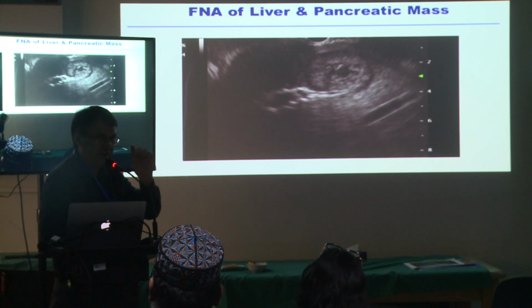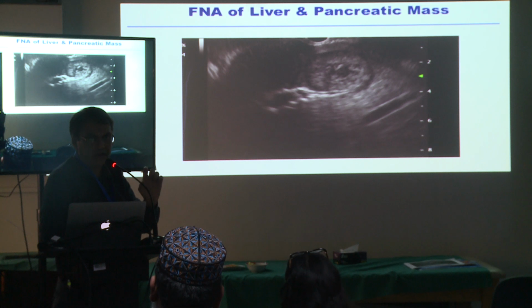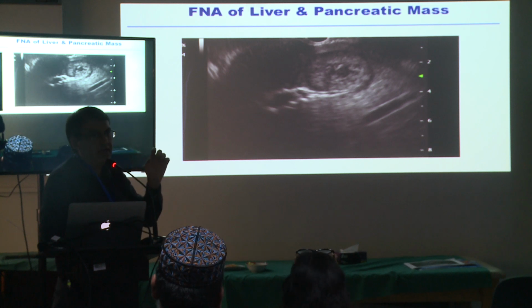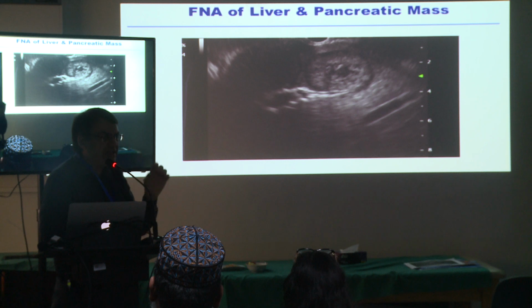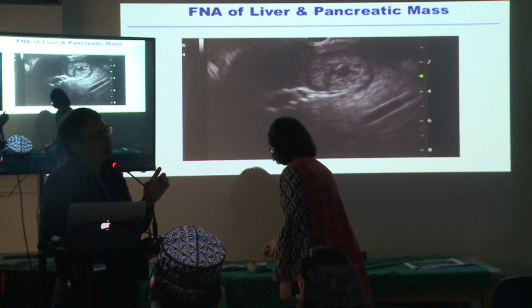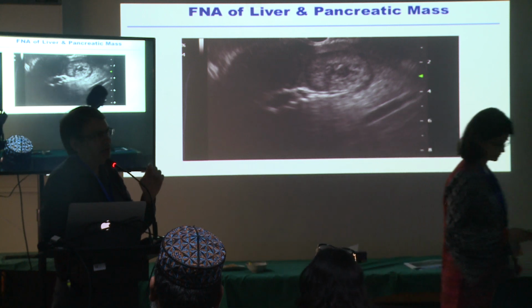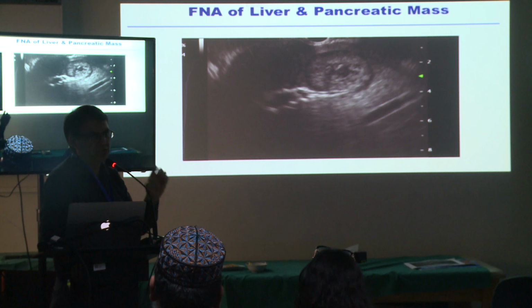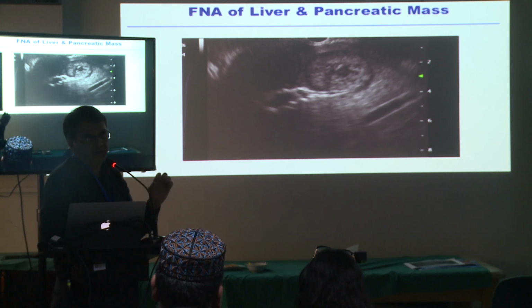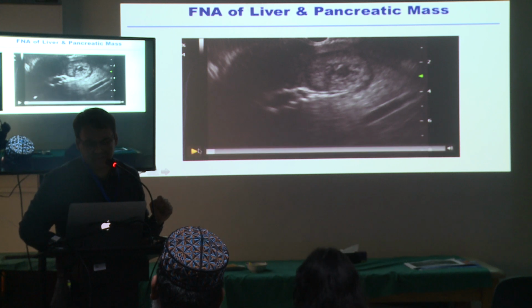And the other thing is, try not to have too much normal tissue between the lesion and the luminal wall. Try to find an area where there's the least amount of tissue. It shouldn't be more than 1 centimeter. That's when you can run into trouble, because if you hit the normal pancreatic tissue, you're going to cause a problem there.